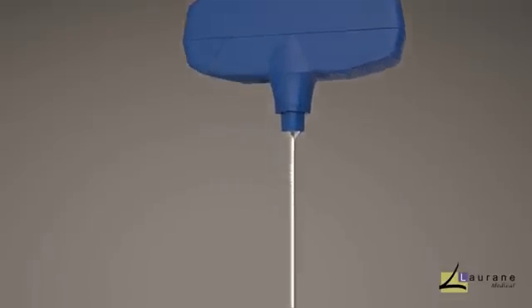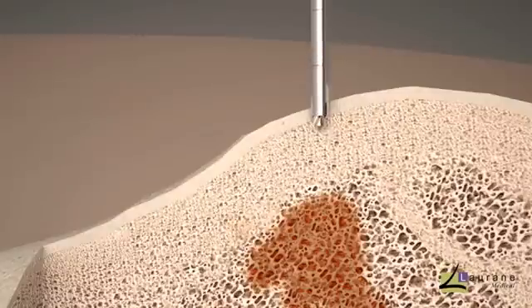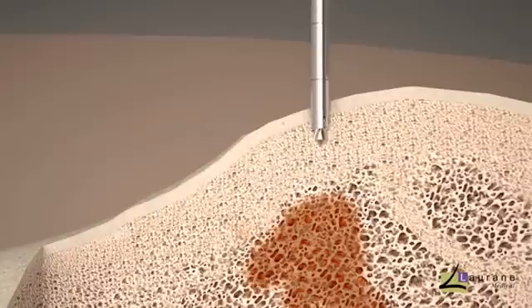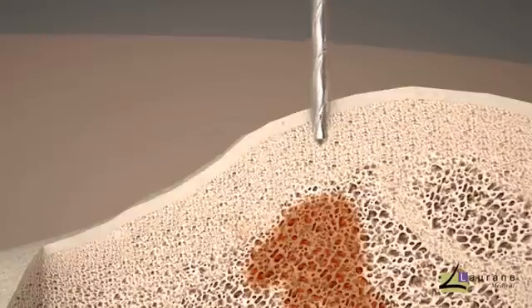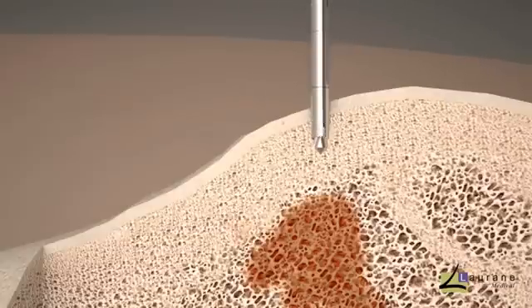With firm but not excessive pressure, the assembled drill introducer is advanced clockwise through the cortex. While the drill tip bores into the bone, the edges of the cannula simultaneously cut around the drill, directing bone debris into the grooves of the drill and out through the cannula. The unique technology of these two elements working in conjunction allows the introducer to penetrate and travel through the cortex with less effort, increasing tactile control.